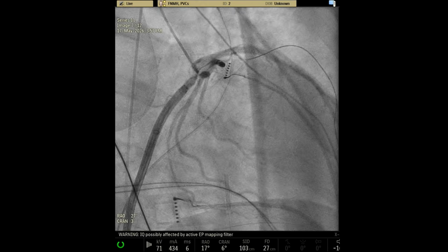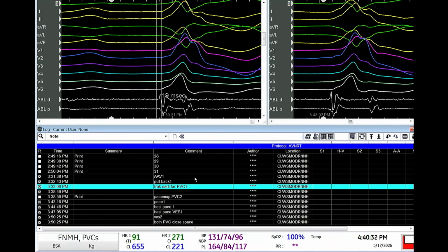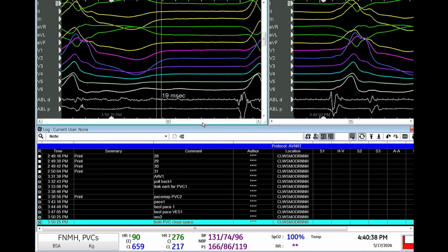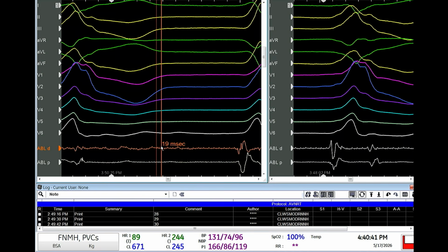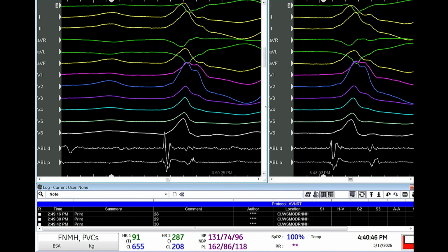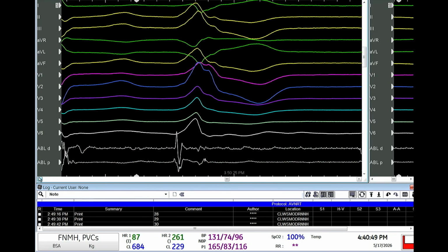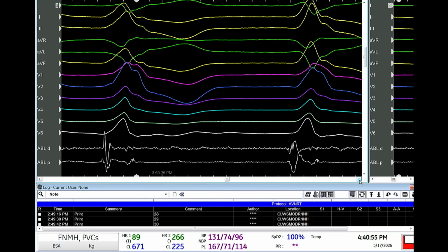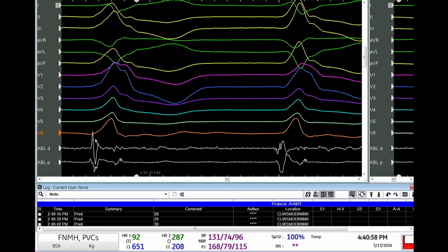Now, please, before we do that, show the 99% pace map, and show when we have the two morphologies. Show both. Now, make that bigger, move it to one side and the other one. Make the review smaller. Now move it this way. No, the other way. Yeah, I want you guys to see this. You see that? The two morphologies, the narrow and the wide. On the wide, it's earlier on the proximal. In the narrow, it's early on the distal. So you have two morphologies that are very close to each other, and we have a good pace map for each one of them.